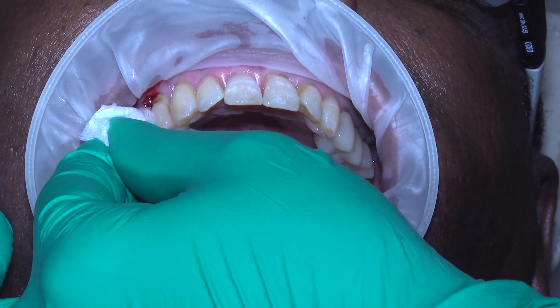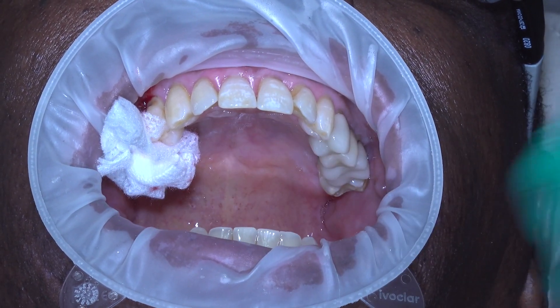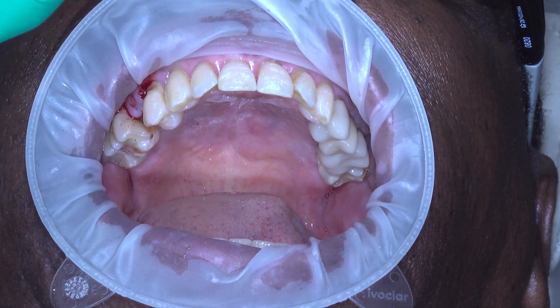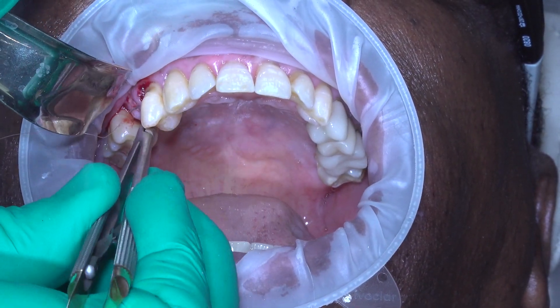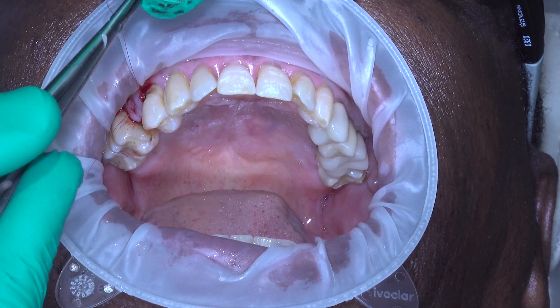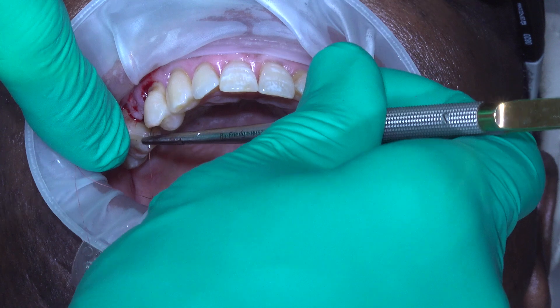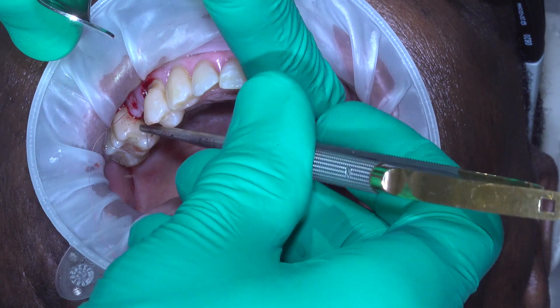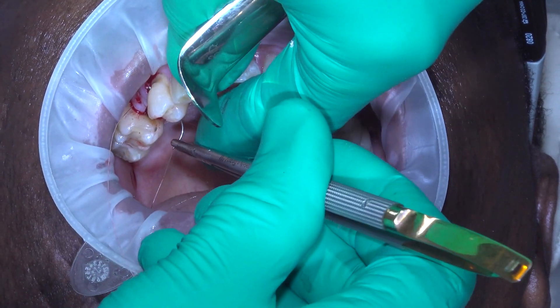I'm a little disappointed in myself. What I'm going to do is just do a regular horizontal mattress suture. Instead of using the suture groove on the lingual side, I'm going to use the tissue on the lingual side to engage the suture. I love these Castroviejo needle drivers — they're round, so they don't look like scissors, more like an art brush. They give you a lot of control with your fingers to rotate. Watch as I rotate the head of this needle into the tissue with just finger motion — just a little twist of the fingers. I use them in pretty much every single case.